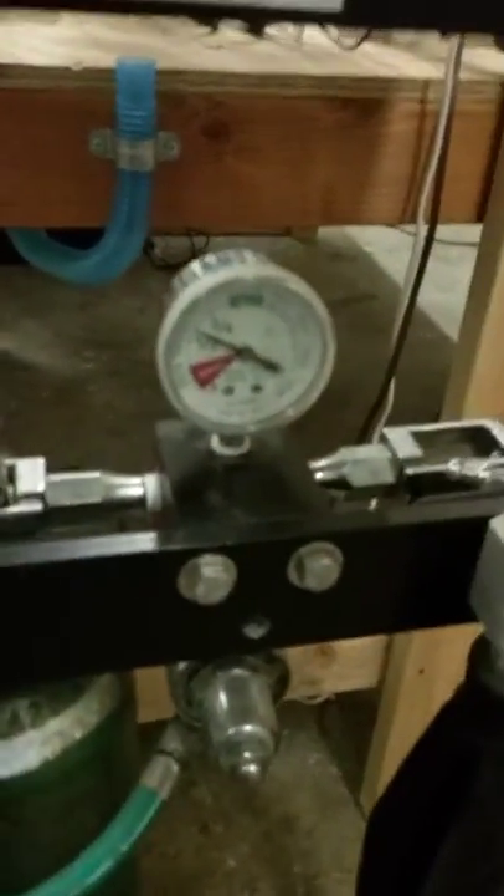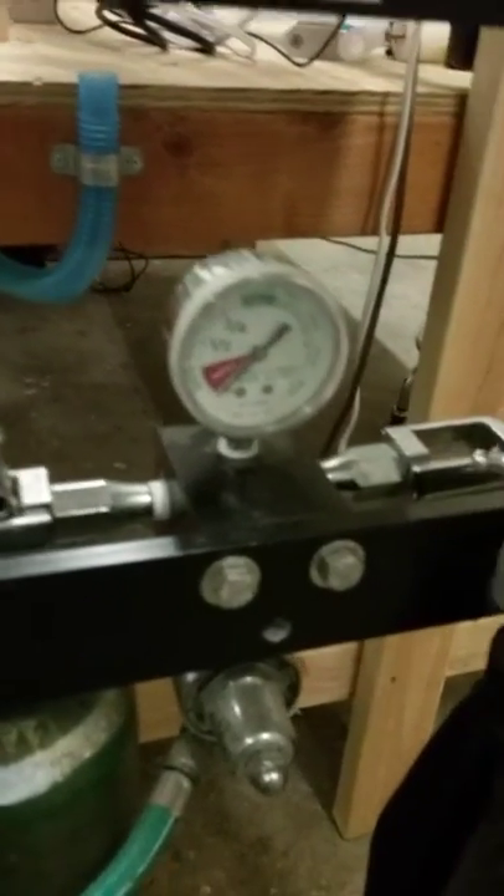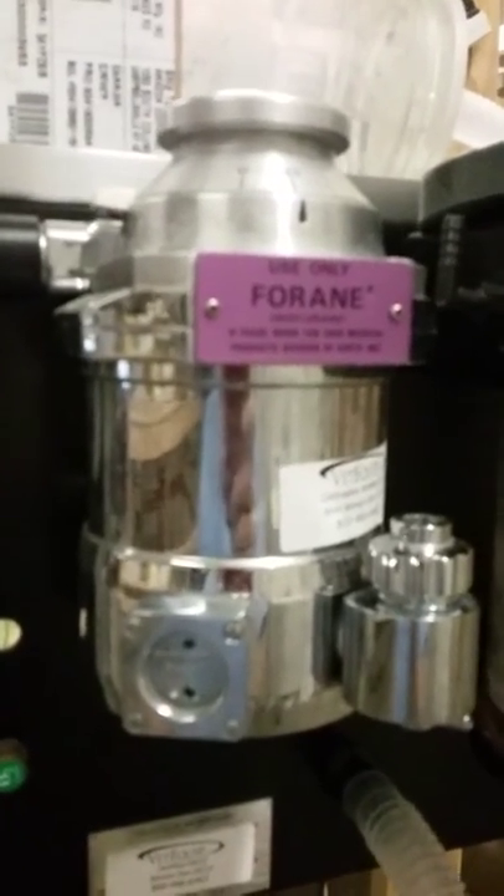Now we'll leave some pressure trapped in the meter, and that can be purged simply by pushing that button there and letting it release.